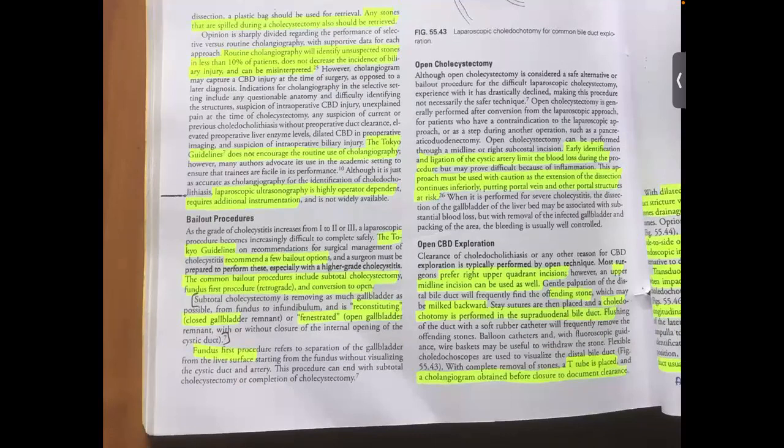So next is laparoscopic ultrasound. The problem with laparoscopic ultrasound is that it is highly operator dependent and requires additional instrumentation in addition to the instruments normally used for cholecystectomy. So that is the disadvantage of laparoscopic ultrasound.